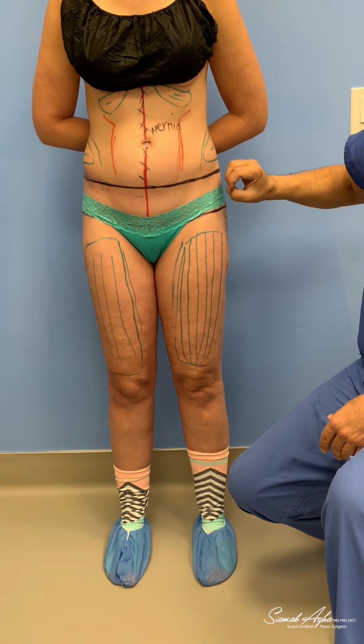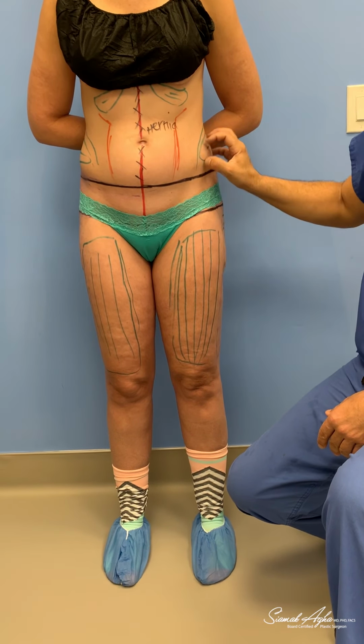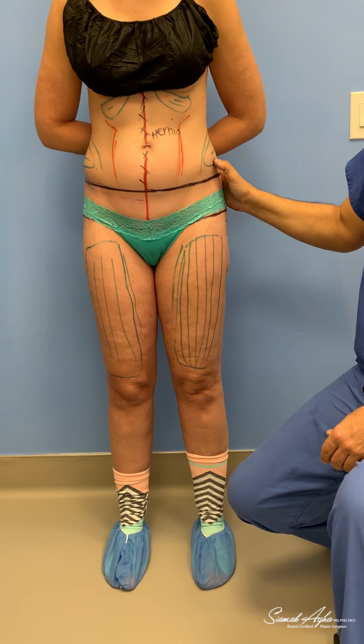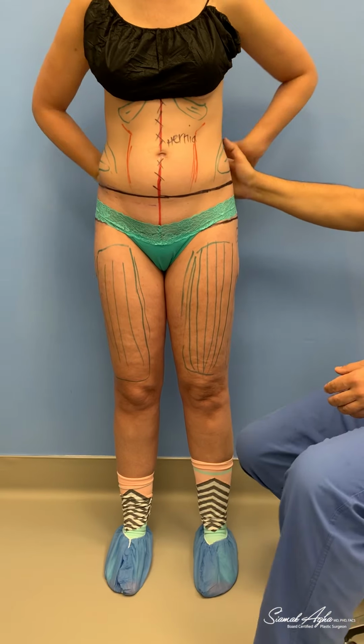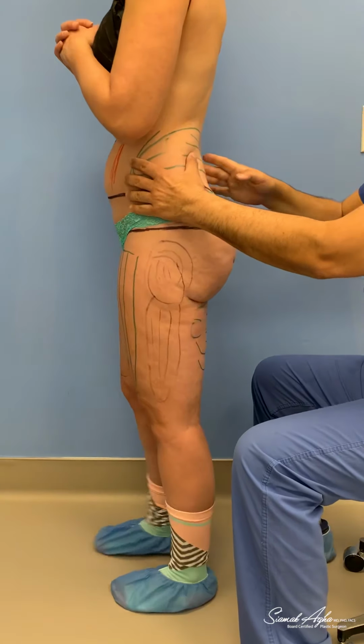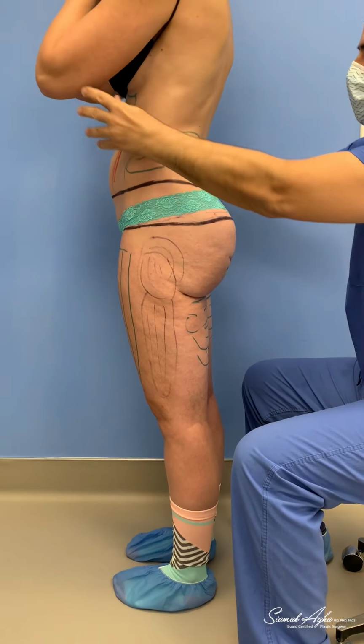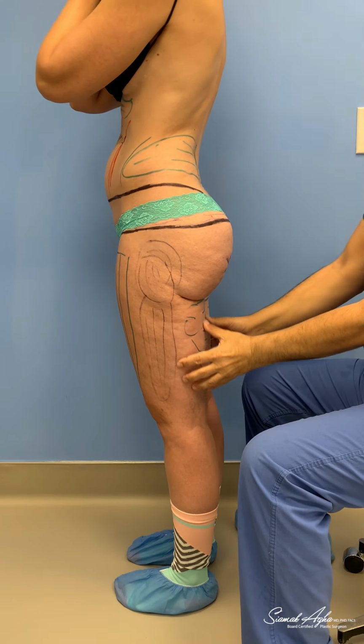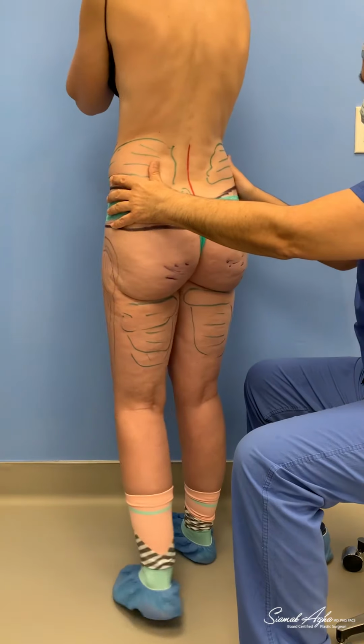And as we do that, we're going to lift her thighs, we're going to liposuction her waist and these areas to create a more defined abdomen. And we're going to do a high definition tummy tuck. On the sides, we're going to be liposuctioning her flanks. And as I said, on the back, we're going to be liposuctioning the thighs.